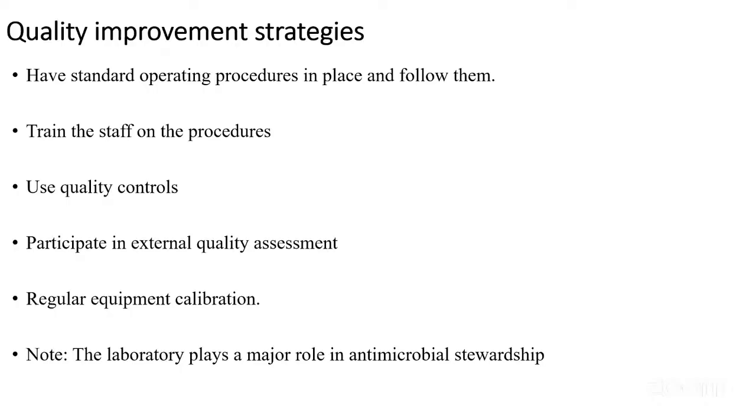So that the processing will be uniform to all the staff. It's not that when one staff is on duty, they are doing their own things, following their own procedures, and the staff the following day has a different procedure. We have to have a standard operating procedure that is followed and is standard for every staff.